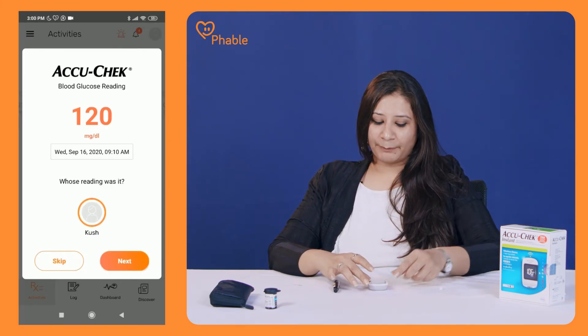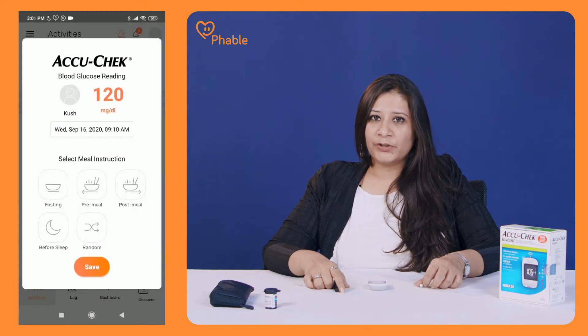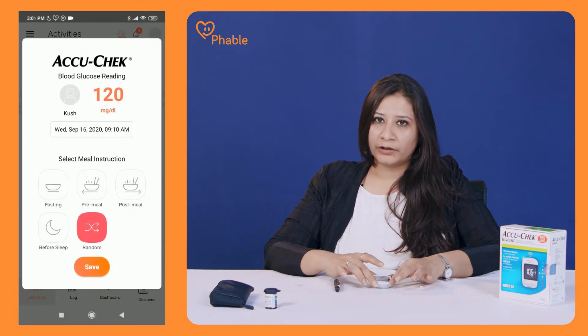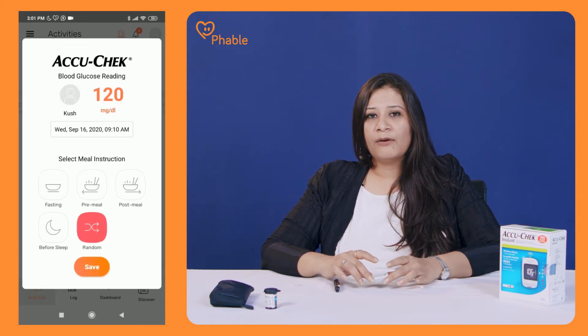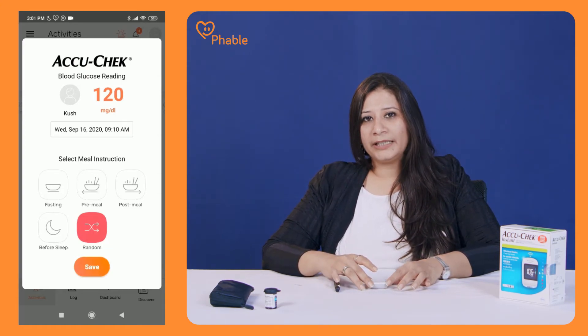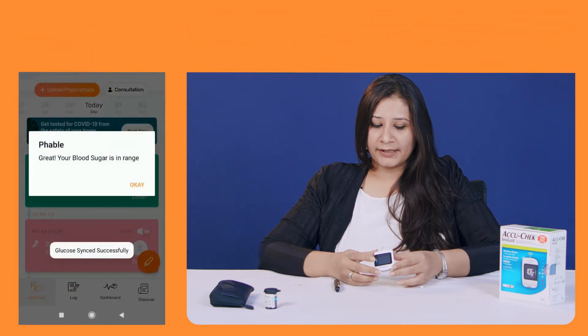Ensure that the blood is now on the strip provided. Once the reading is captured, make sure that your device with the Fable app and the monitoring device are kept at close range, and turn on Bluetooth for the device to capture the reading automatically. If you're using an iOS device, you will have to sync the data manually, but it is just a click away. Visit the app, go to the activities page and click on blood glucose. You will find an option to sync the data. Once you click on it, the data will be captured from your device and synced in the app.